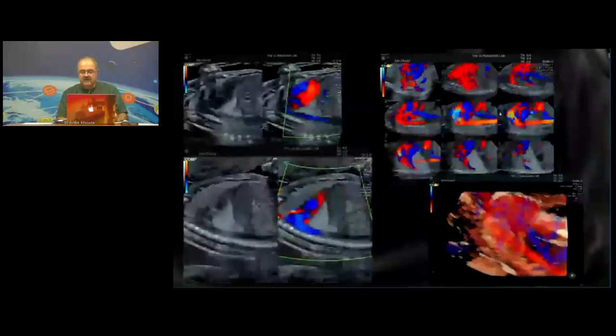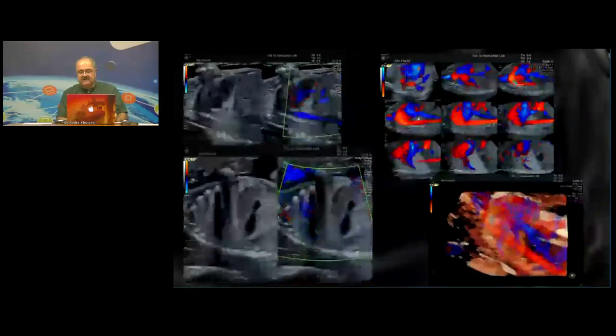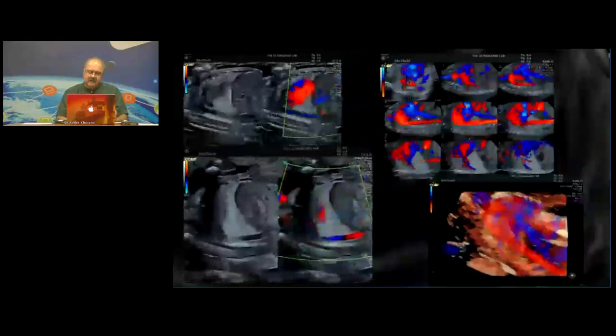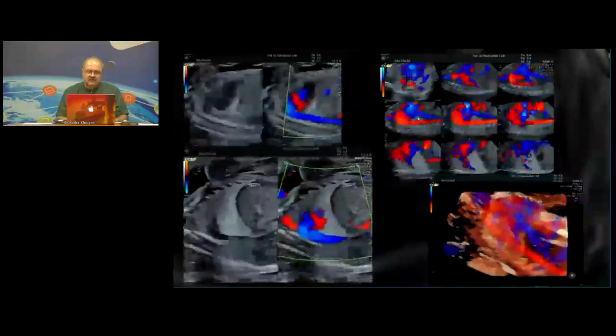And look how beautifully it works when you use a TUI. The entire aorta shows absolutely no vessels coming to this. It cannot be a sequestration, must be a CPAM. My prognosis becomes just a little guarded. And I say, look, we'll see you again.